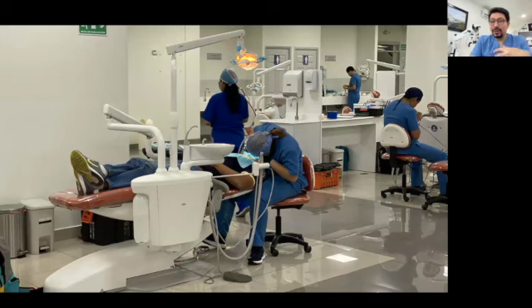She's trying to do her best. And she's trying to have a proper vision. Because of that, she is in that position. And that is not ergonomic at all for her. Can you imagine working like this for 5 years? You are working like this 5 years and you are done.